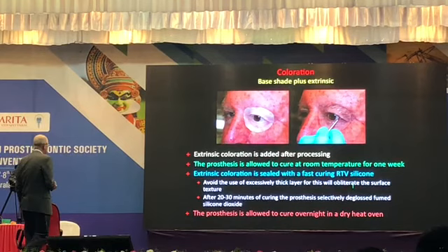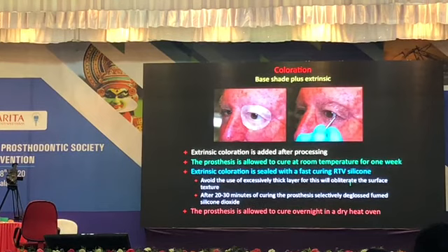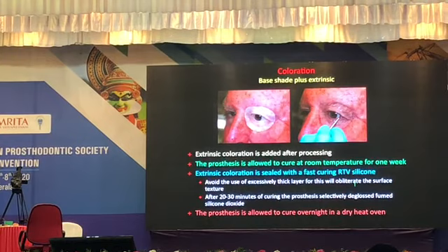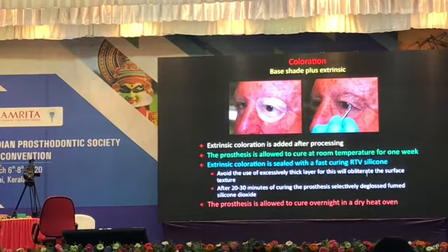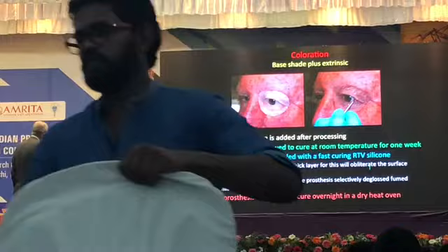So, when you're painting extrinsically, you want to keep the solutions as thin and as least viscous as possible. If the mixture, and we paint basically with a mixture of silicone adhesive, and we dilute the silicone to make it as watery as possible so that we don't fill up all the pores and the surface texture is not obliterated. So that's really important. You want to avoid the use of excessively thick material while you're painting, while you're mixing your paints.